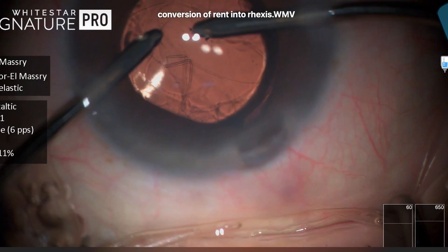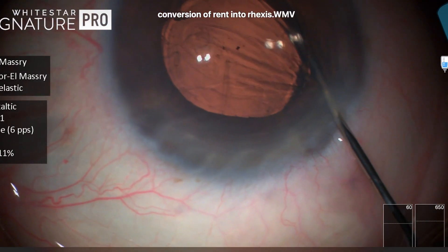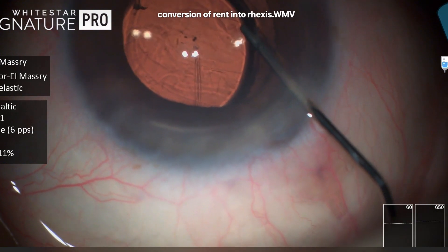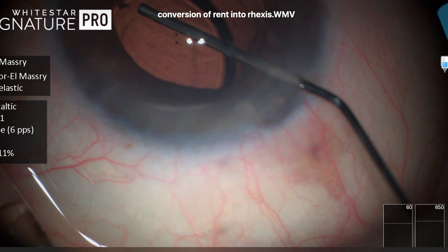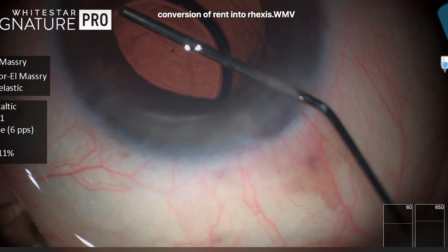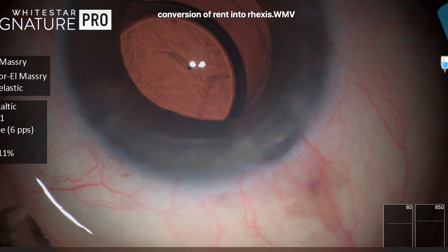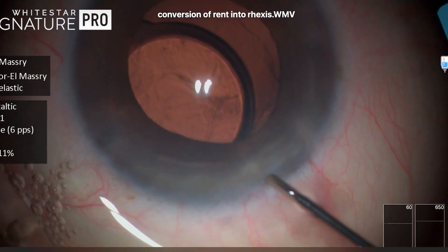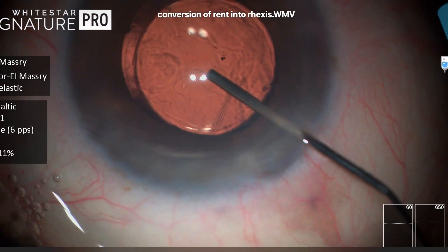The fluidics confirm there is no vitreous, but before that there was a nuclear particle behind the lens. So here we're using just dry aspiration to aspirate this small fragment without bringing out vitreous with active fluidics. After that we do some passive irrigation to remove any viscoelastic remnants.